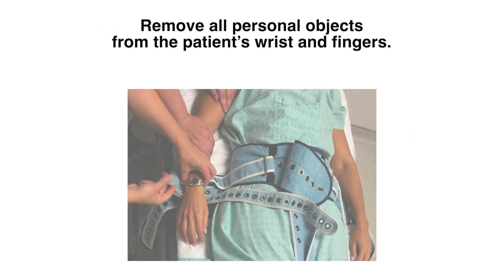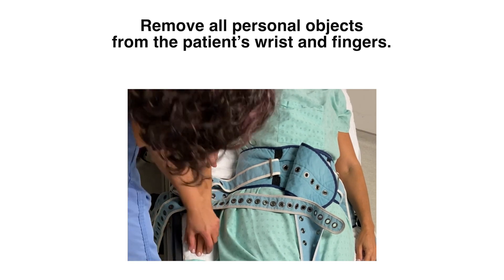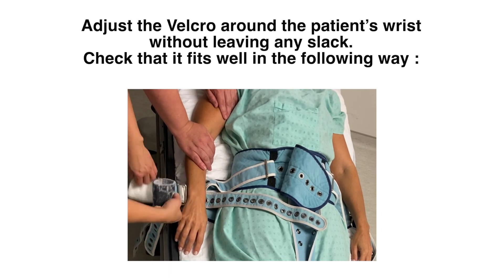In this section, we will review the immobilization of the upper limbs. Make sure to remove all personal items from the patient's wrists and fingers. Adjust the Velcro around the patient's wrists without leaving any slack.